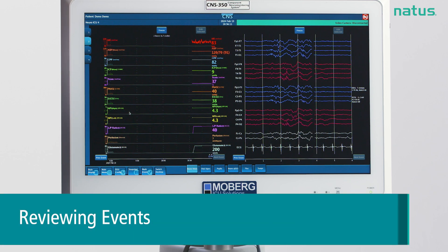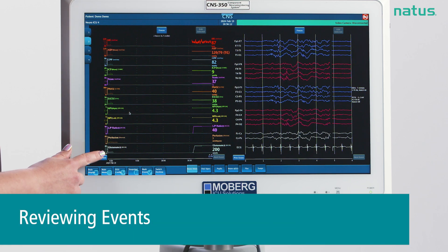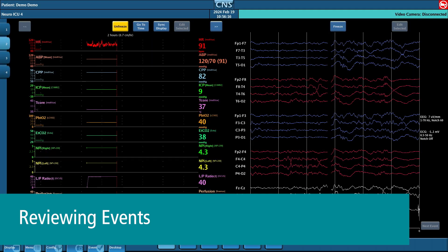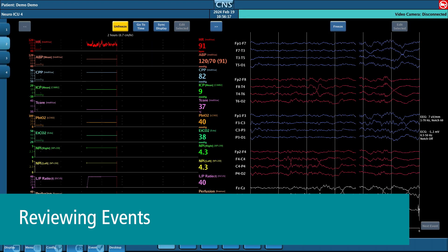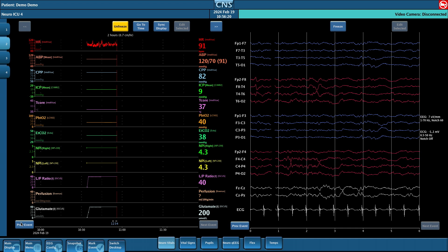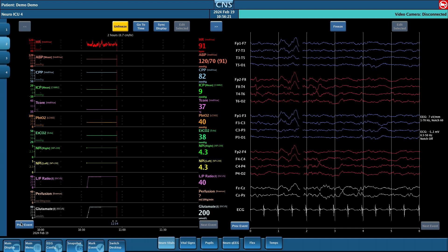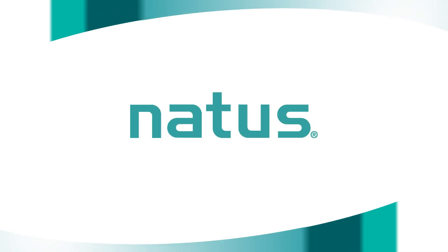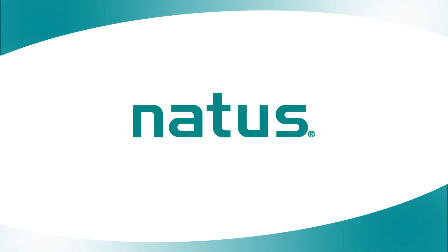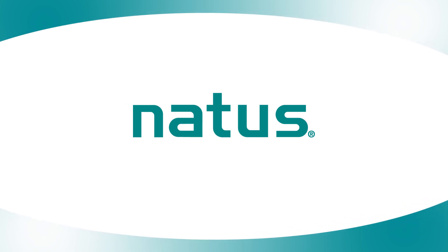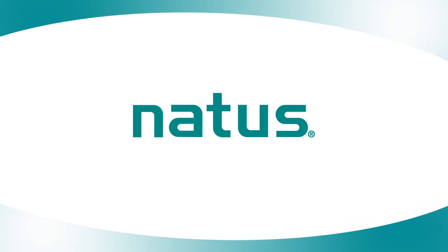To review events on the CNS monitor, you will tap on previous event or next event, and it will show you the event and the data at the moment in time. Tap unfreeze to return to the real-time data.